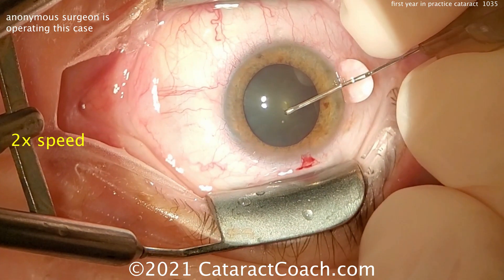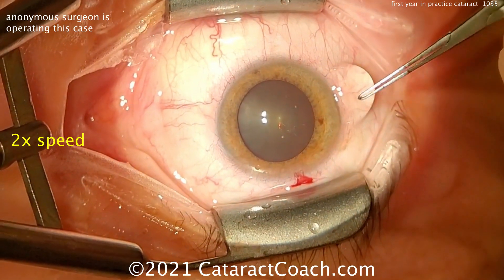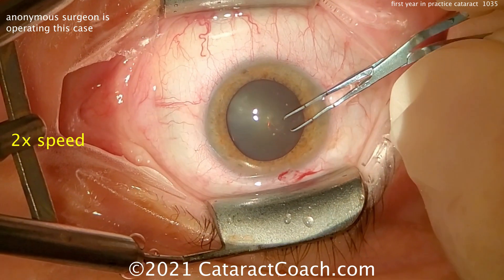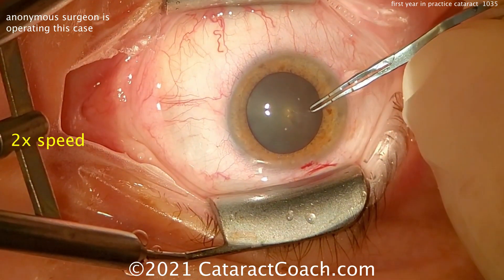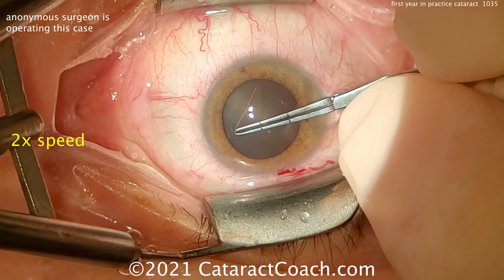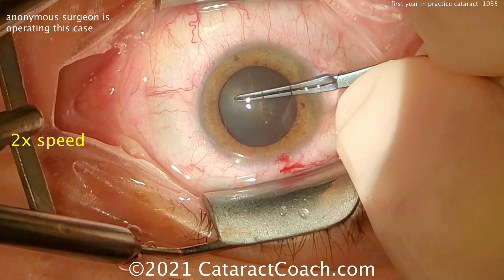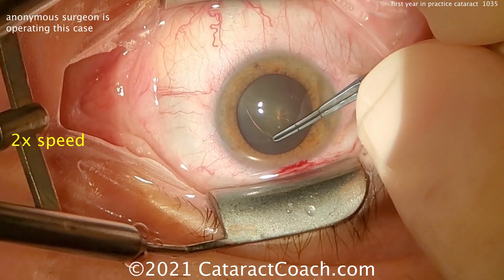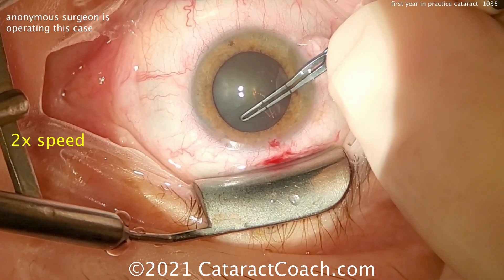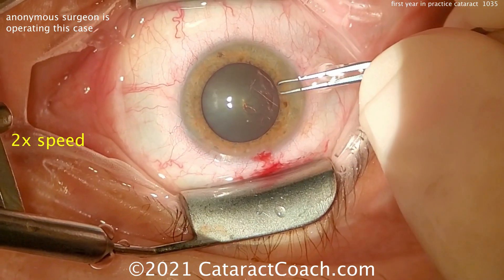Now assistane tone. Starting the capsulorhexis here. I like the forceps that are marked off — two and a half and five millimeters — so you get a good idea of sizing right there. Nice pivoting technique. Pivoting in the incision means you keep the viscoelastic in, which makes the capsulorhexis easier to perform. A little on the generous side maybe, but that looks pretty good — nice round rex, we'll take it.